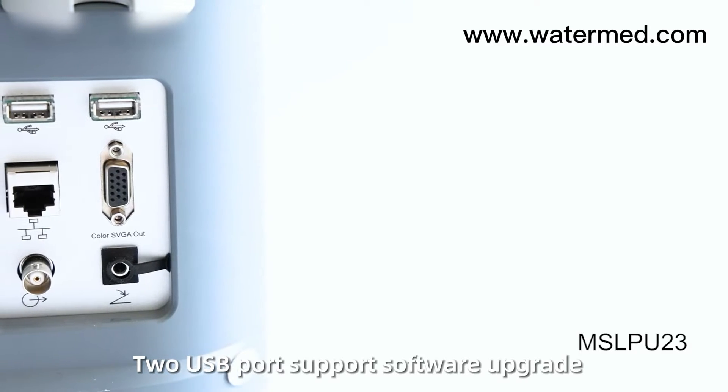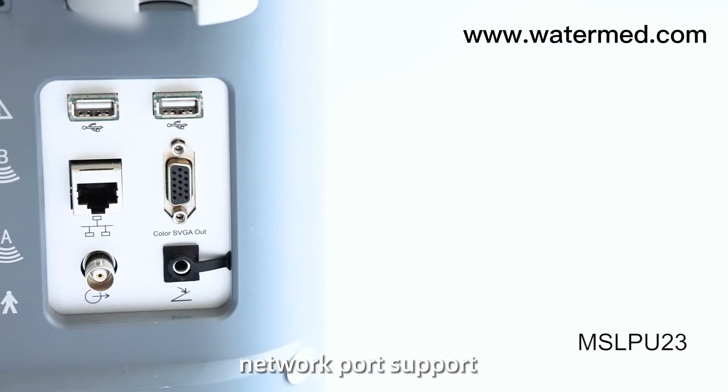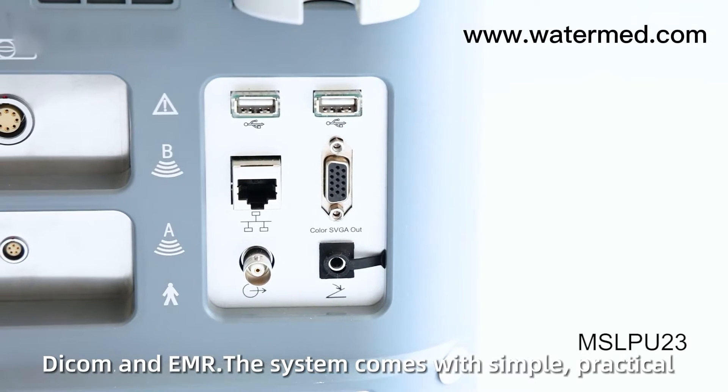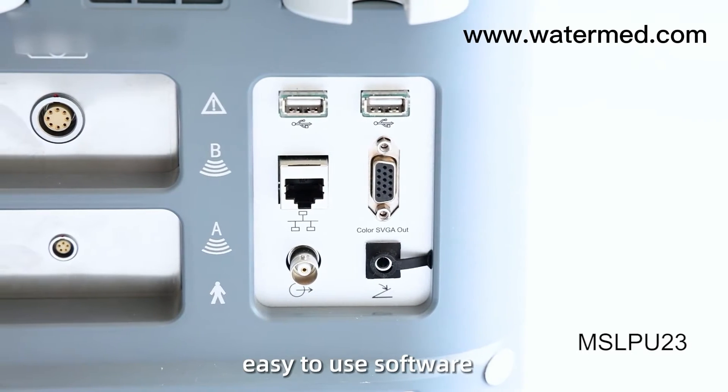Two USB ports support software upgrade, and a network port supports DICOM and EMR. The system comes with simple, practical, easy-to-use software.